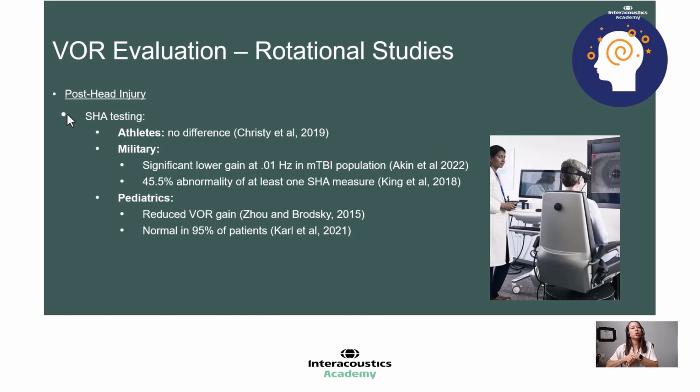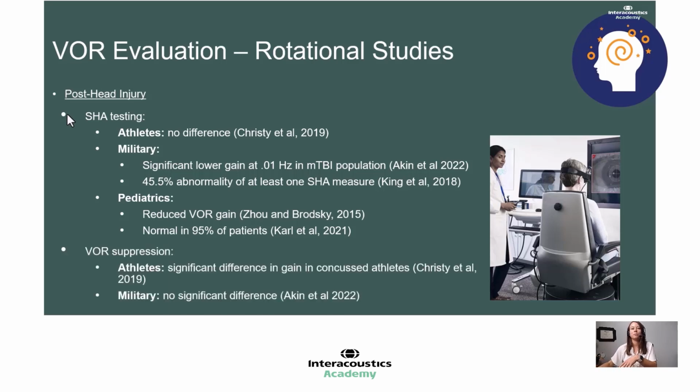The consensus from chair testing has been kind of split depending on population, whether sinusoidal harmonic acceleration, where the chair is just moving back and forth, we're looking at the VOR in the dark, whether that is sensitive or not to the TBI population. We've got many studies that show that it is, and some studies that show that it isn't, which shows just the unique individualized nature of concussion research.